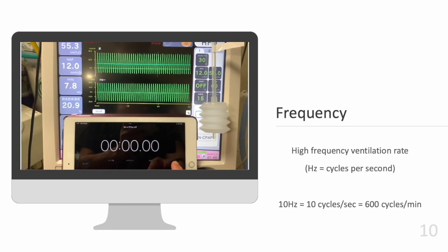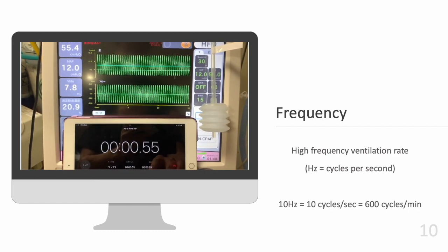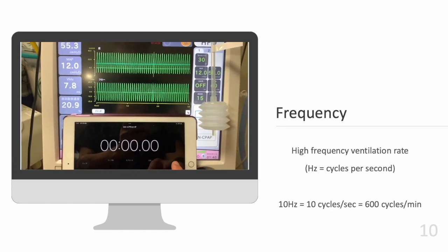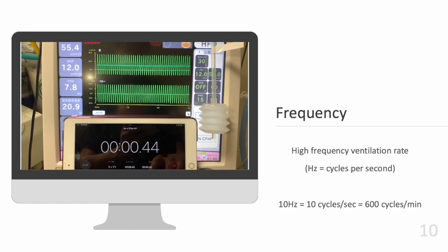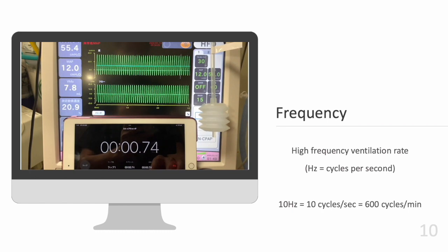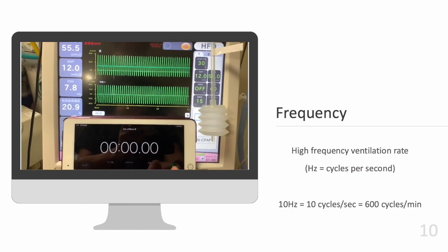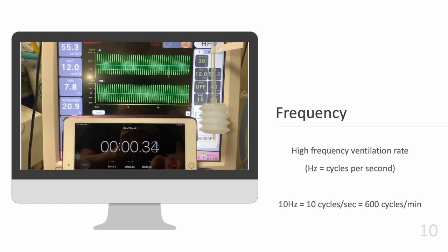Earlier, we talked about frequency. The number of breaths taken by an HFO is expressed in Hertz. At 10 Hertz, this corresponds to 10 times per second, or 600 times per minute. I actually checked it in slow motion. The ventilator was set to 15 Hertz. The test result shows that the test lung moved 15 times per second as per the 15 Hertz setting.